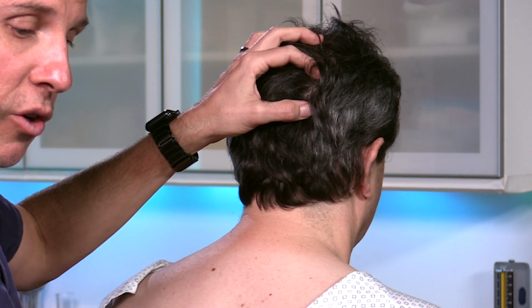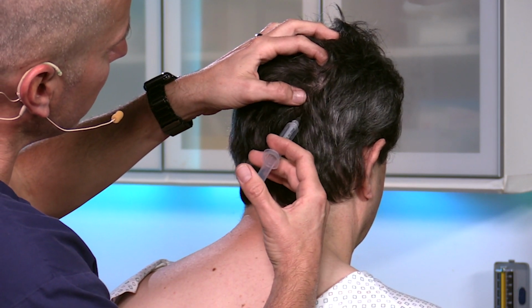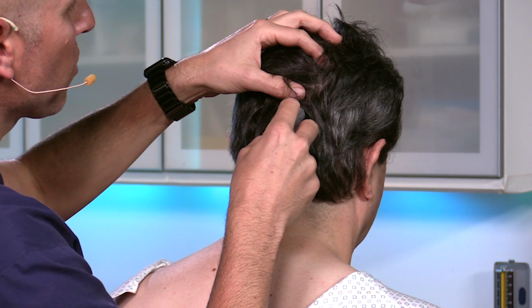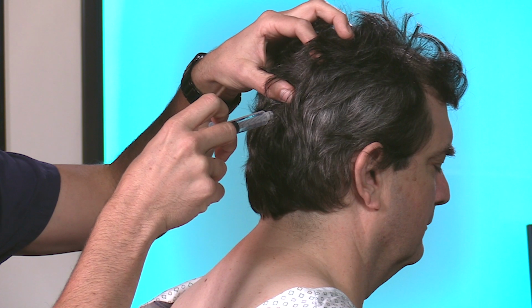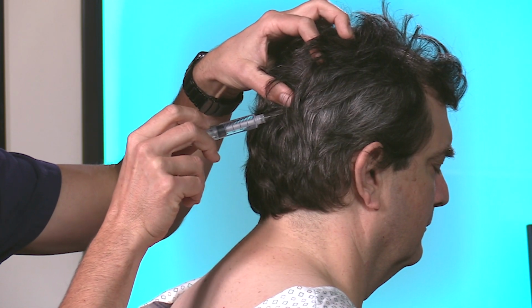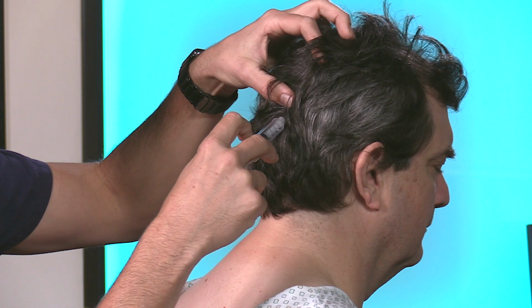Once you've found your spot, you want to grab your needle. I have my anesthetic. This is the greater occipital nerve. And when I go in, you just want to go under and make a little bit of a skin wheal, pull back. Make sure you're not in any vasculature, little skin wheal. And then the bone is really superficial. So once I get in, I tuck it in, I hit the bone, and then I just inject 1 cc of local anesthetic. The next thing I'll do is I'll pull out and I'll fan it to the right. Do the same thing, pull back, inject a little bit more, and then fan it to the left.